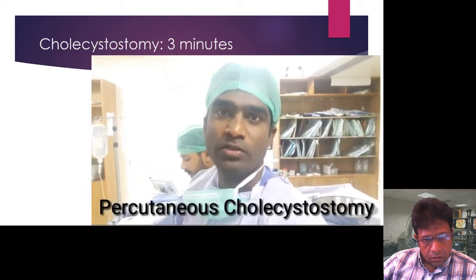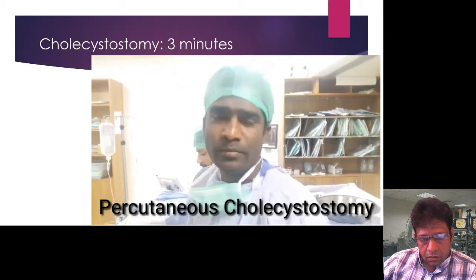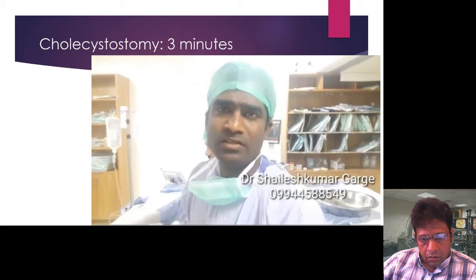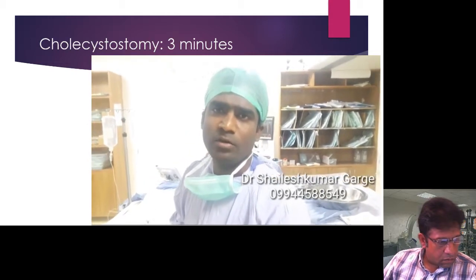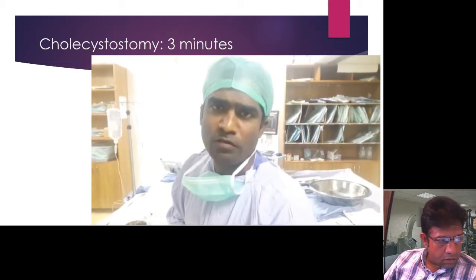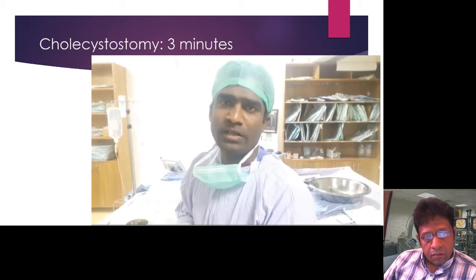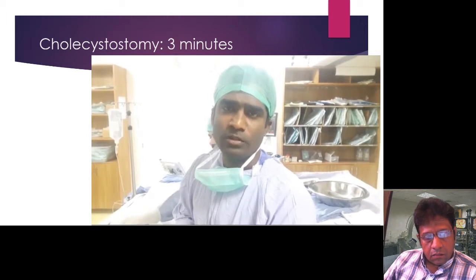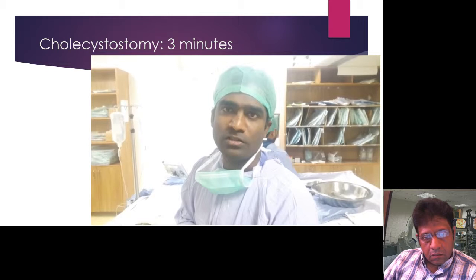Today I'll demonstrate a case of percutaneous cholecystostomy. So this patient is having cholecystitis with a severely distended gallbladder, and there's a tiny calculus around the neck of the gallbladder. Because he looks a little septic, we are planning for the settlement of the infection by draining the bile using the percutaneous cholecystostomy. Once he settles down, then we can plan for the elective cholecystectomy.